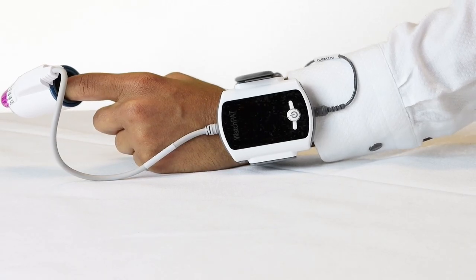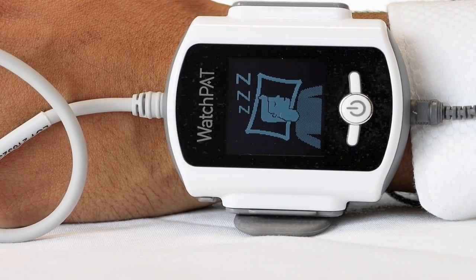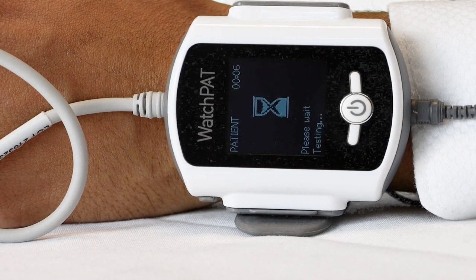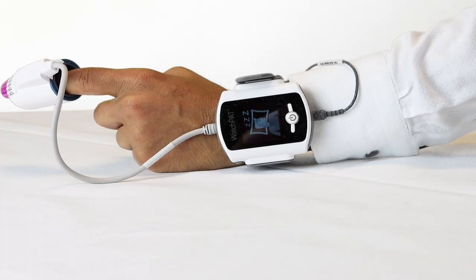Firmly press and hold the white center button until the watch pad screen lights up. A good night message will appear on the screen indicating that the test has started. The screen will turn off by itself within a few minutes. Please remember to keep your equipment on if you get up during the night.